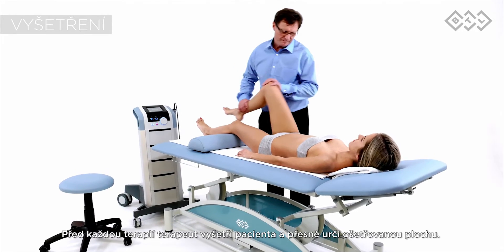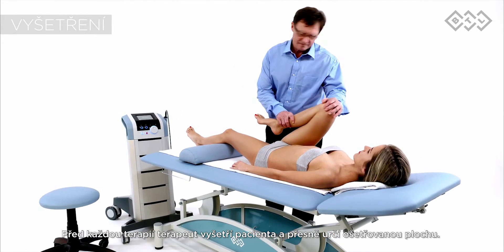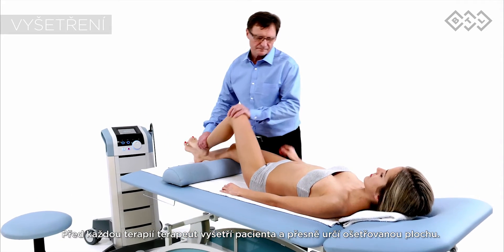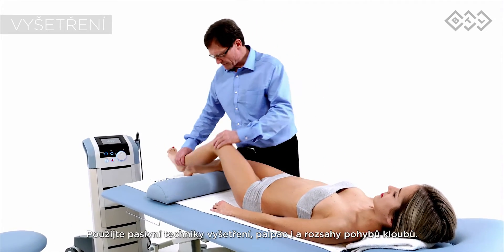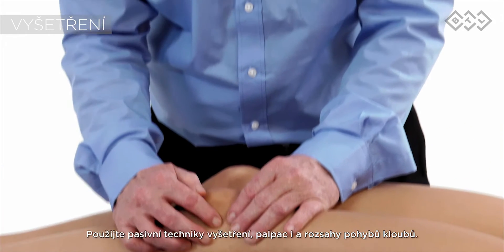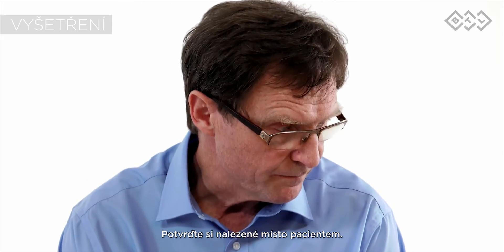The therapist is to clinically examine the patient prior to every therapy and locate the area to be treated precisely. Use passive testing techniques, palpation, and joint range of motion examination. Confirm the painful area with the patient.